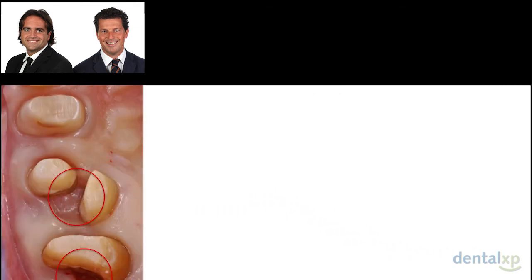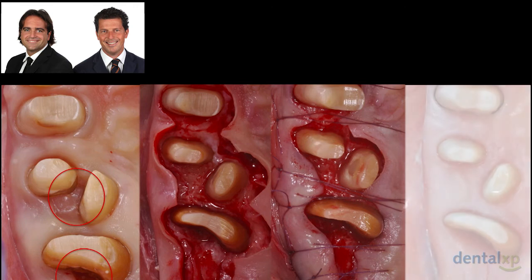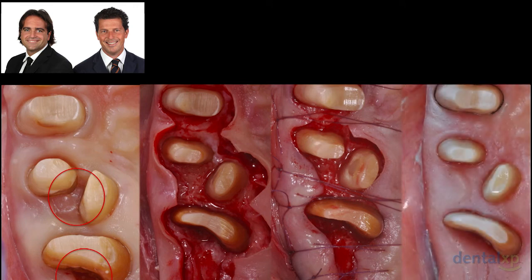So let's now take into consideration this periodontal case with furcation involvement with 2-wall infra-bony defects. Before working on the final prosthetic restoration, it is mandatory to first treat the periodontal disease, reestablishing a positive bone and tissue architecture. Notice in the right side picture the tissue healing the day of the final digital impression, with already the powder in place.